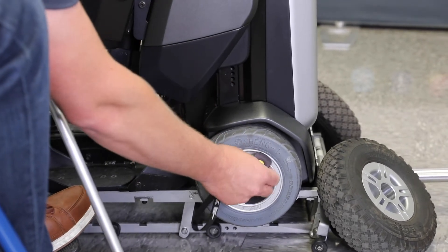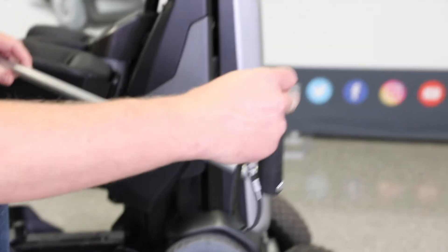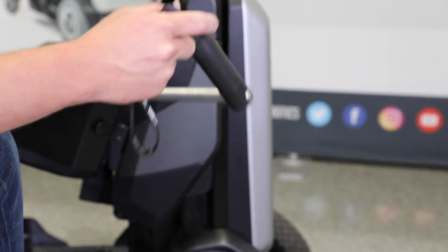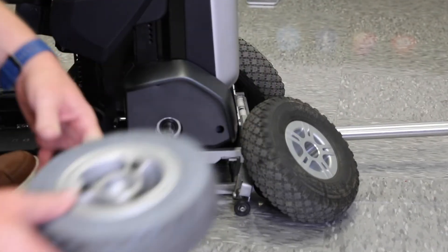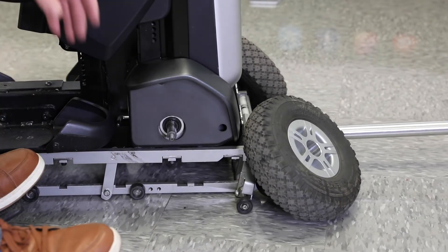This is a magnet — I can just stick it in there and it will stay in place until I put on the outdoor wheel. I'm just going to pull that wheel off and set it to the side.